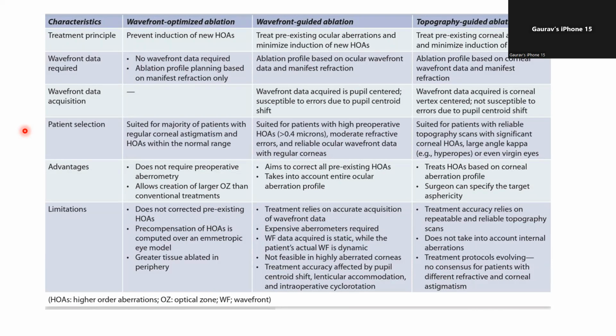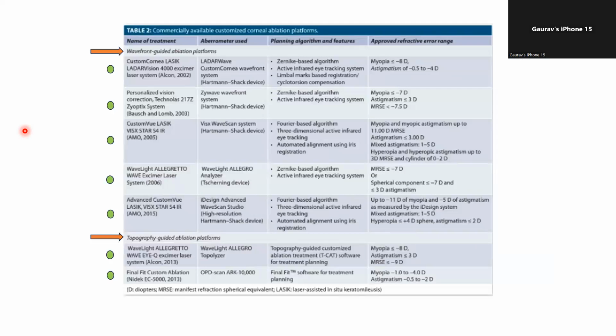So we used to do aberrometry, and then after that, we had to see the data and try to decide whether this is going to help the patient or not. But typically, the aberrometry was done in a dilated pupil, and then we would try to correct. Frankly, the lenticular aberrations would change completely in a cycloplegic state, and as you said, they're dynamic. So all the aberrations are dynamic.